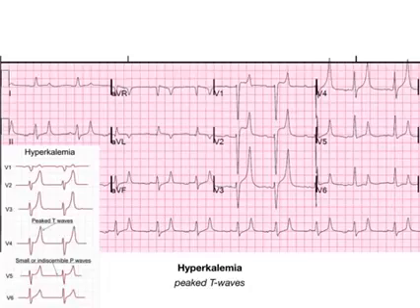So instead of it being a really spiky thing that you could like cut your finger on if you touch the tip of it, that's what a peaked T wave is. ST segment is more blunted, right? It's more rounded at the top because it's the whole entire segment. And I really want to hone in on that because people will think that this is a STEMI from leads, say V2 to V4, but this is really just a peaked T wave.